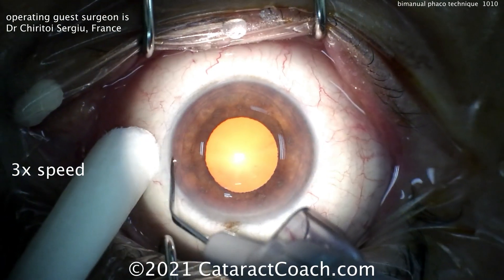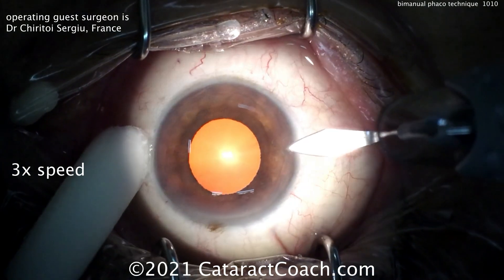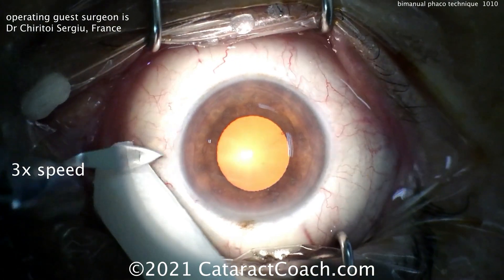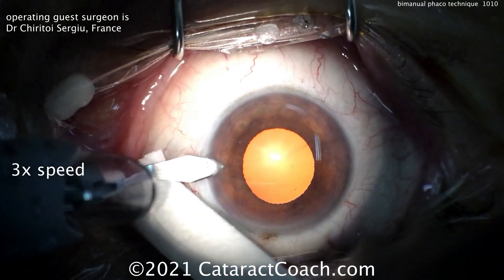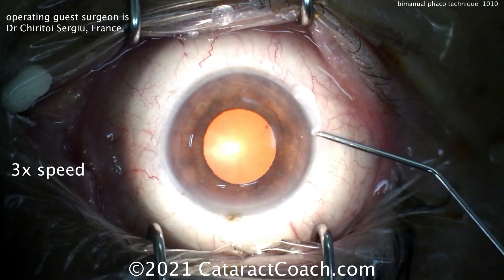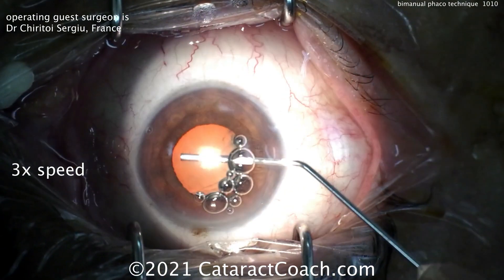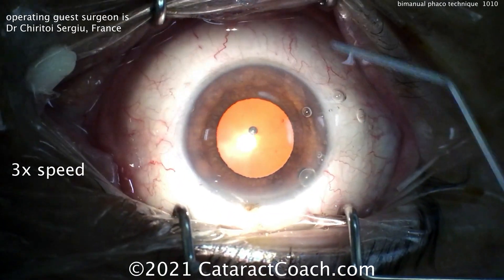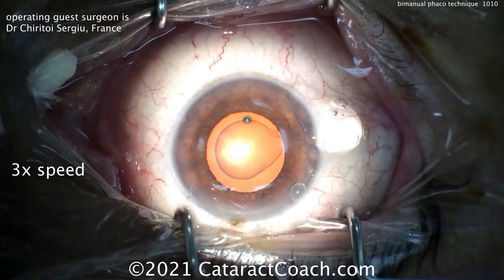Here's the eye. We're going to show you the whole video at three times normal speed. Making the first incision with a keratome, and then another incision opposite with the same keratome. These incisions are relatively small, probably about two millimeters in diameter. Now injecting the viscoelastic, and we'll do the capsulorhexis.